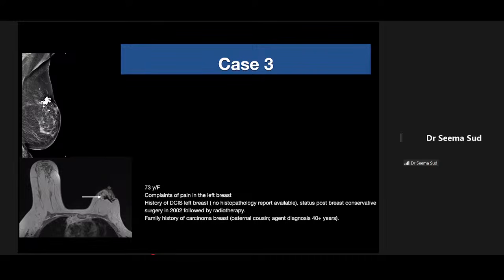And you can see here where the radiotherapy was given, there's a lot of calcification, the breast is hard. The same thing you can see on MR, this area of dark signal is all calcification. And there's disfigurement, you can see the nipple has moved up. So breasts like these can be pretty difficult to biopsy.